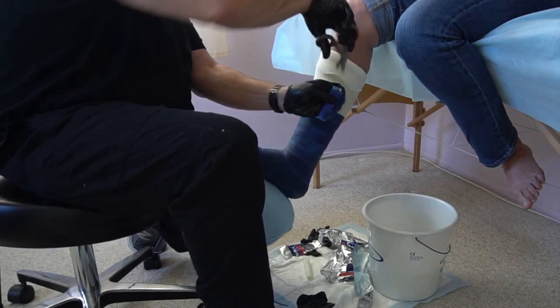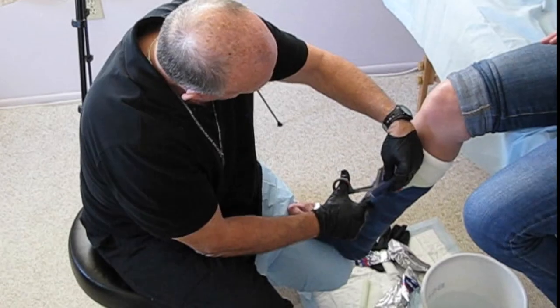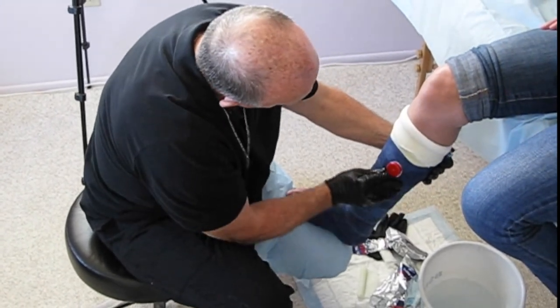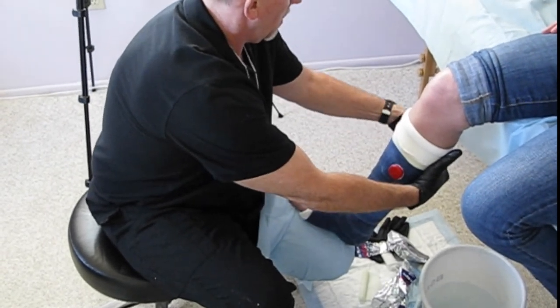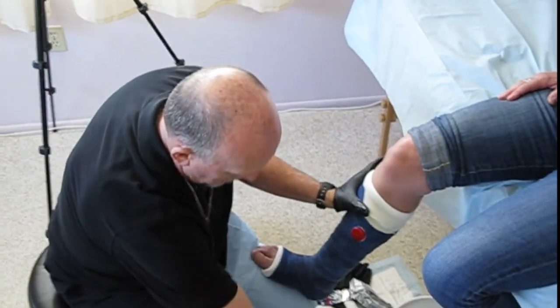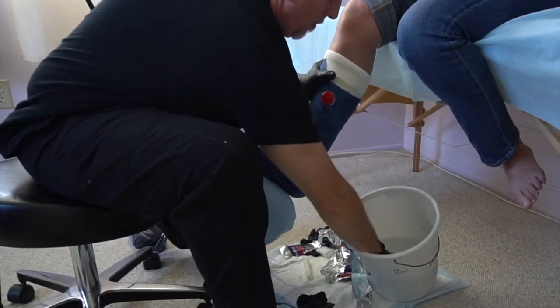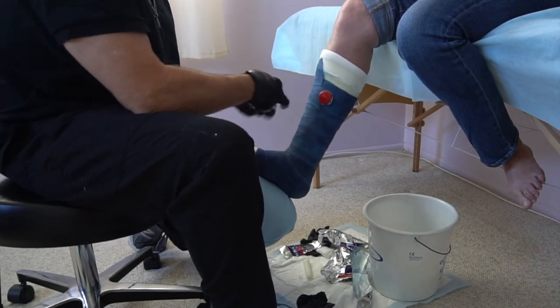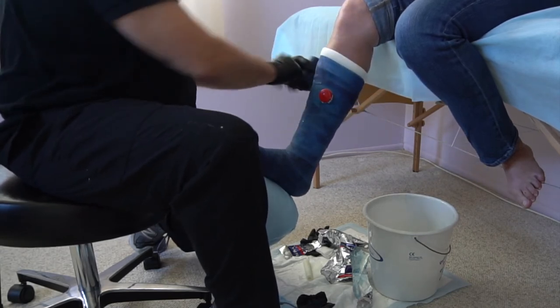I'm going to angle towards the bottom center, pull that around, and do it across the top area — stretch it, pull it around.